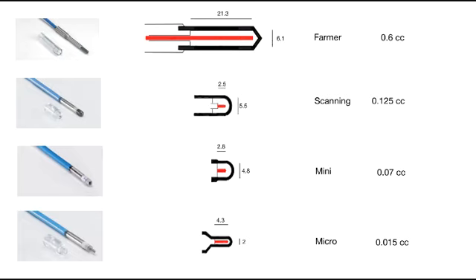We'll talk about the advantages and disadvantages of these different chambers more in a minute. But one of the key things is that a large volume chamber will give you more air, and you get a higher signal.